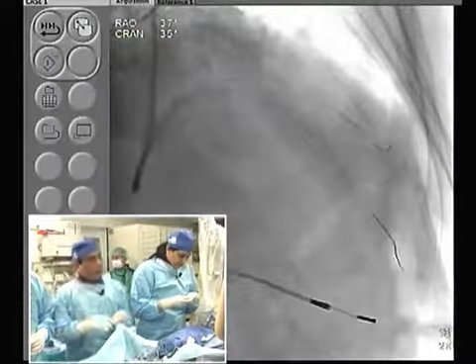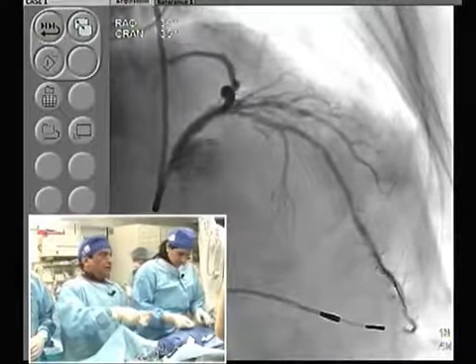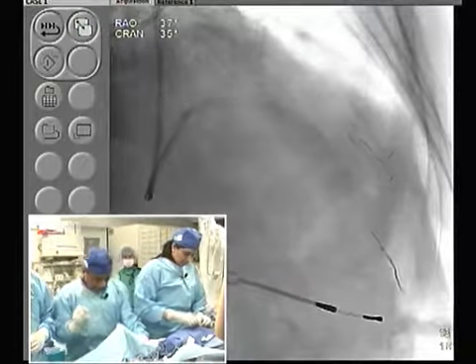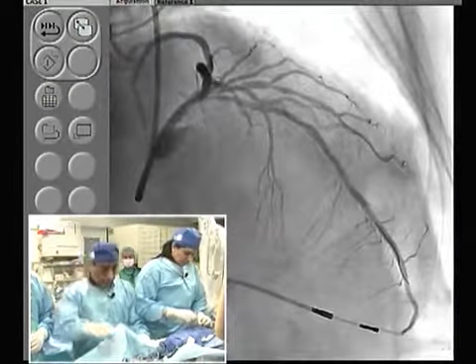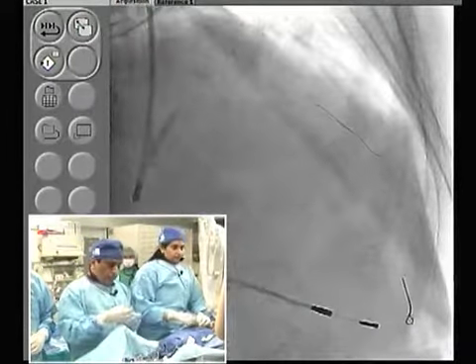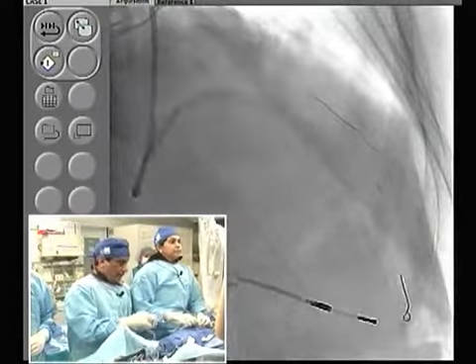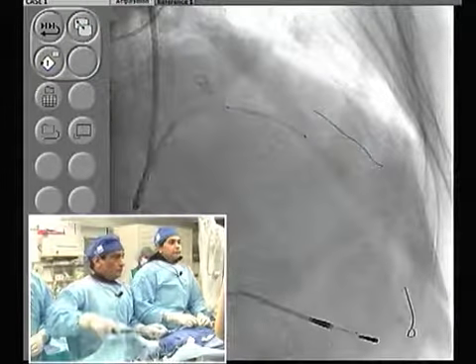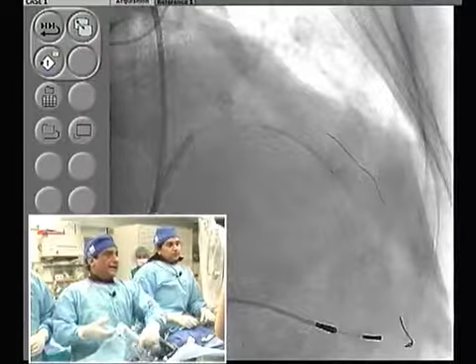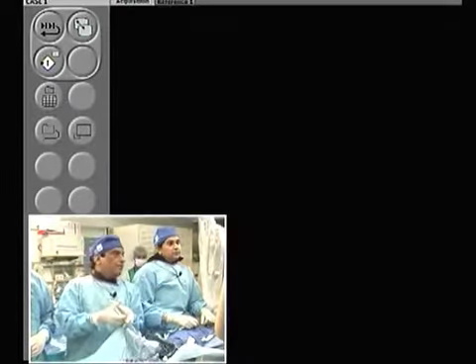Although again, as I said, see that ostial diagonal has not completely opened up yet. So this case will very likely close after your stent of the LAD. You don't think you should have put in a 2.5 balloon in the mid segment of the diagonal? Well, if we need to. Actually, I think the distal area after the ostium has now become a little more significant, and we may decide to just put a stent there also, two stents in the LAD and two in the diagonal, because as the point you made, it is looking more significant now than before.